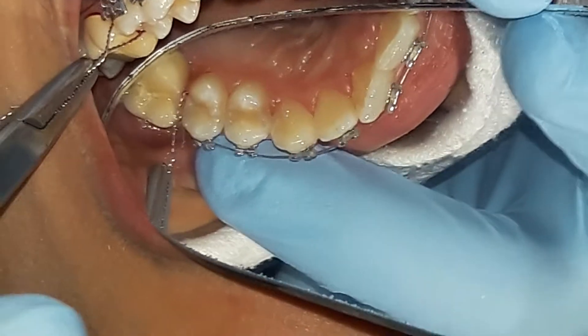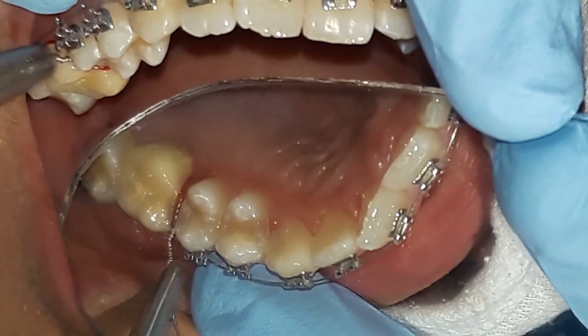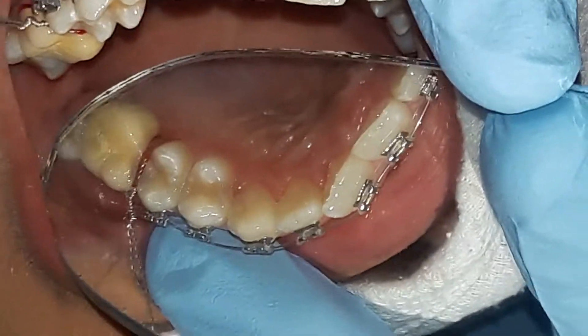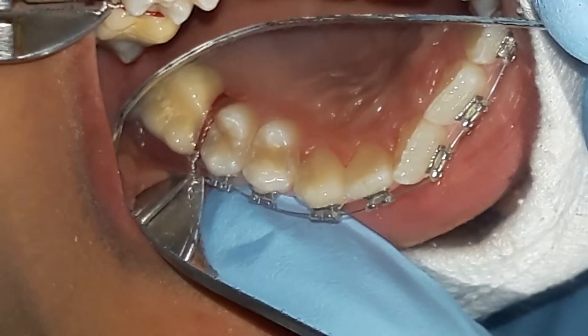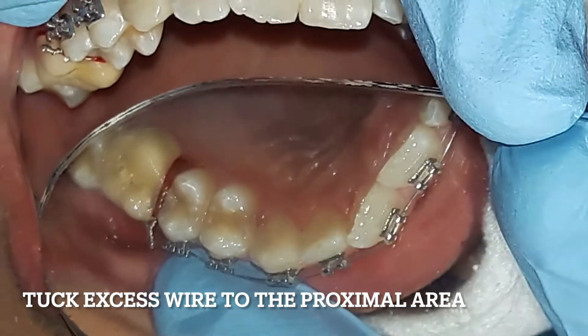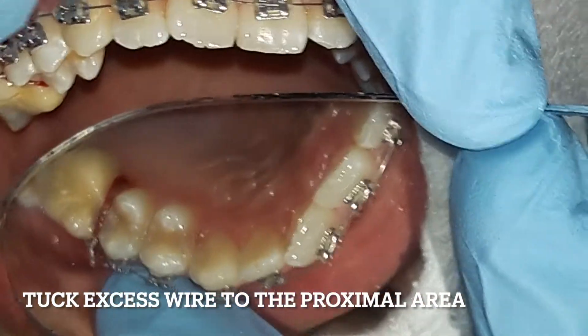The patient can perceive the tightness as discomfort — that's my clue to stop. I then cut the excess wire leaving about 2mm, and with a wire tucker I tuck back the excess wire towards the proximal area.